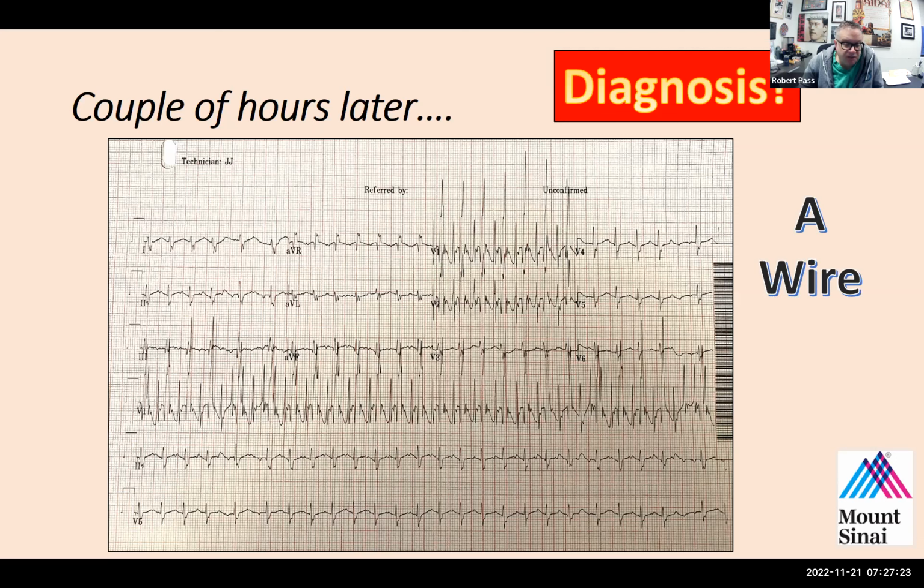So yes, you would always give a bigger dose. I remember a case where I learned this lesson about how air in the chest can make it very difficult to cardiovert somebody. Years ago, I was involved in an ICD implantation, and I was assisting a surgeon, and we could not cardiovert. At that time, we used to do so-called defibrillation threshold testing, which is that every single time we put an ICD in, we would induce VF and make sure that there was a minimum of a 10 joule safety margin between what was required to terminate tachycardia and what the maximal output of the device was.